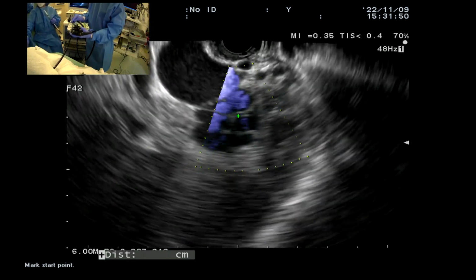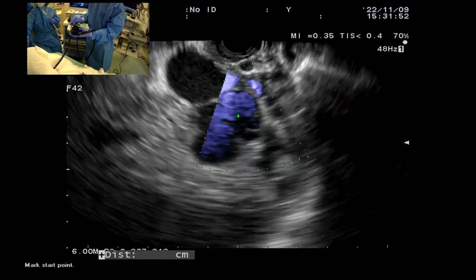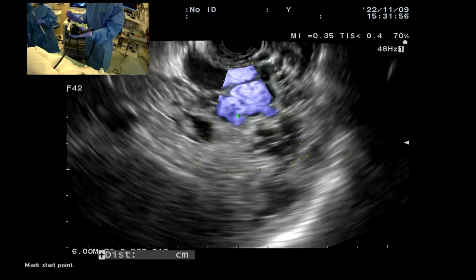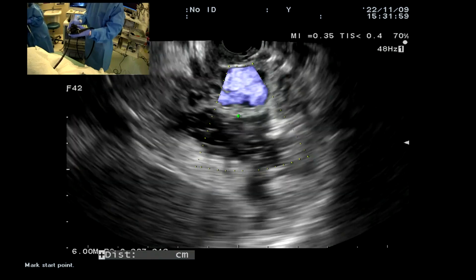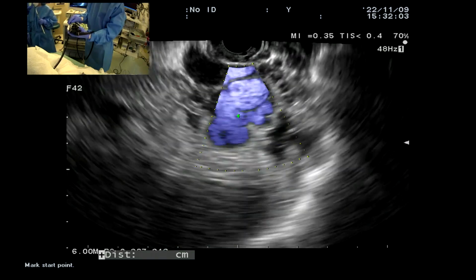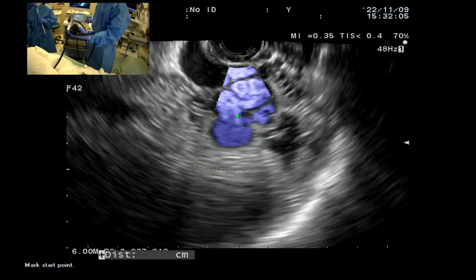Right, there it is. So this is actually a beautiful access to this, and this will also avoid any bleeding since we're coming from the back and not through the very thinned out mucosa. All right, so I think we're ready now.